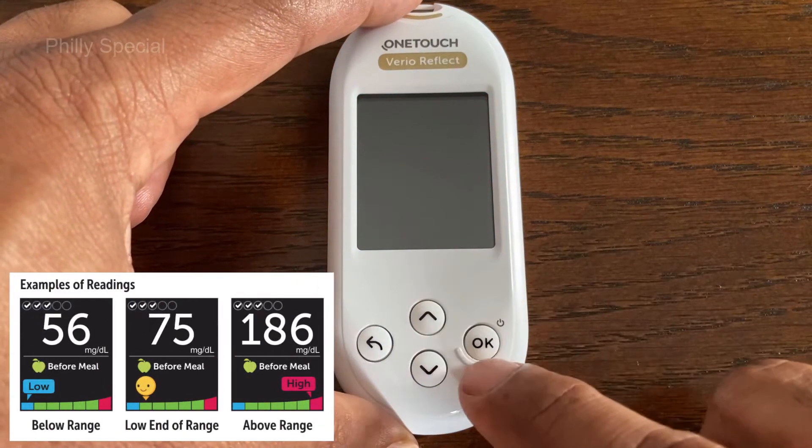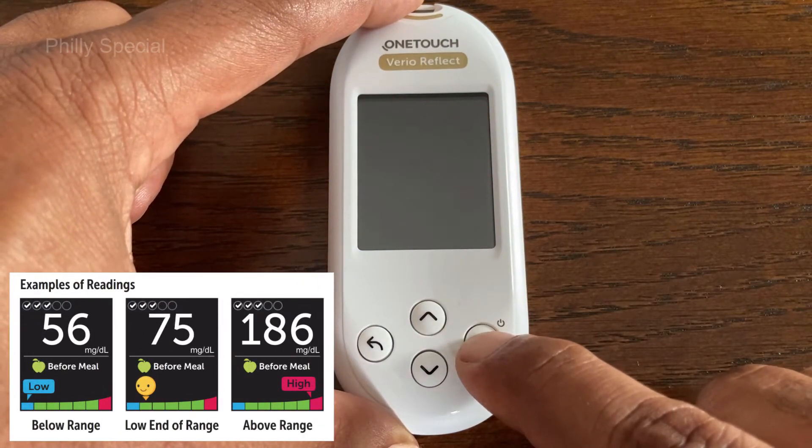This video shows how to edit or change the range limits on a OneTouch Verio Reflect blood glucose meter.